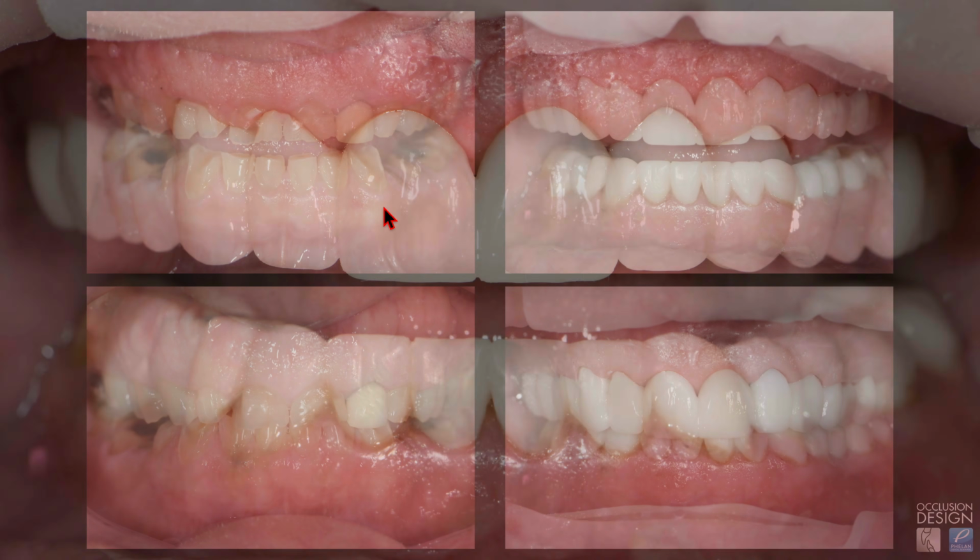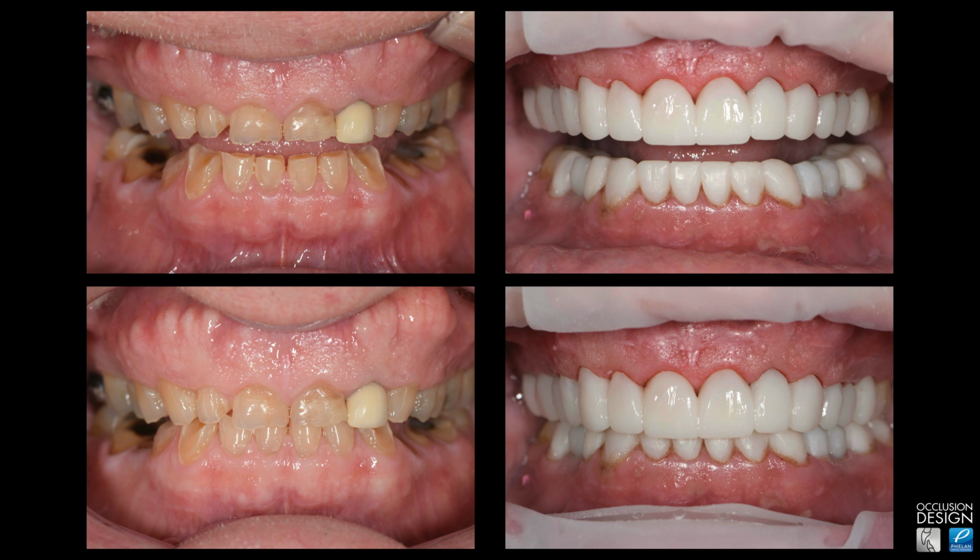I needed to do some adjustments, and then I have the patient test out the aesthetics, especially phonetics and the occlusion, over a couple of weeks. Then I bring them back in and do a couple more adjustments. Ultimately I take off the upper posteriors, because we were finishing the uppers first, and take the bites. Obviously, before we do that, we're going to do the two composite resins on the posterior teeth. And so here is before and provisionals.